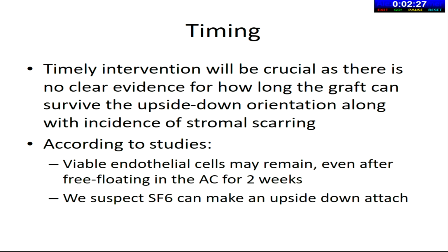So timing. Timely intervention will be crucial, as there is no evidence as to how long the graft can survive in the upside-down orientation, along with the incidence of stromal scarring. According to studies, viable endothelial cells may remain even after free-floating in the anterior chamber for 2 weeks. However, I would give you a caution that if you rebubble or tamponade with SF6, you can actually make a graft stick upside down, in which case the cells may be heavily damaged. And if you had done that, then maybe it's better to do a repeat DMEK graft.